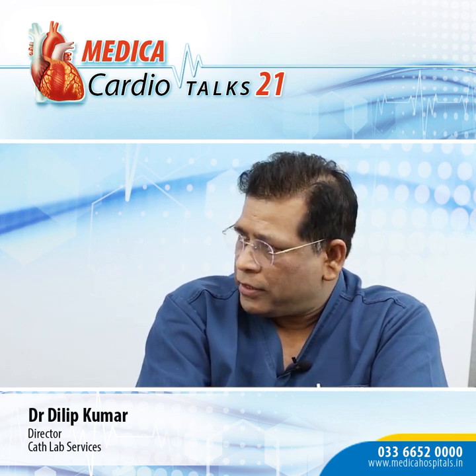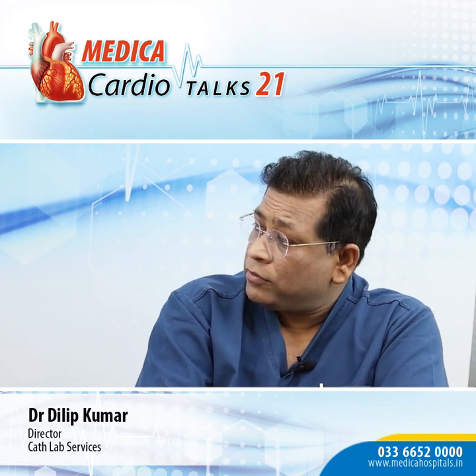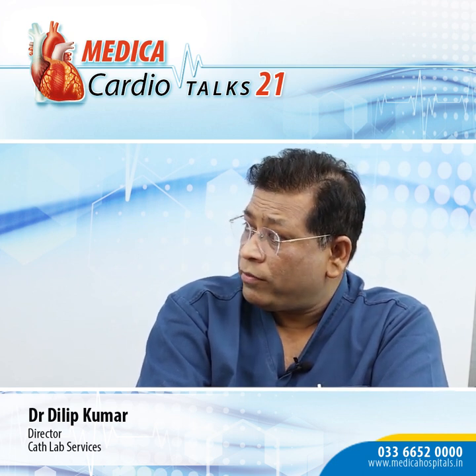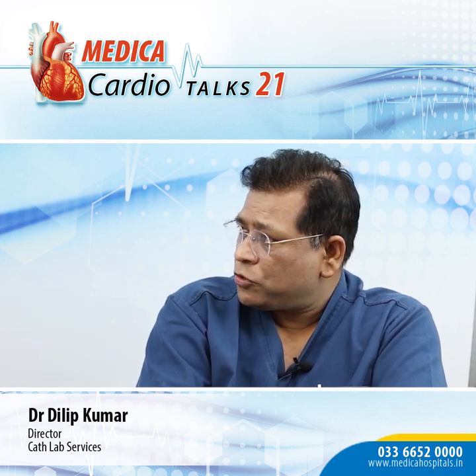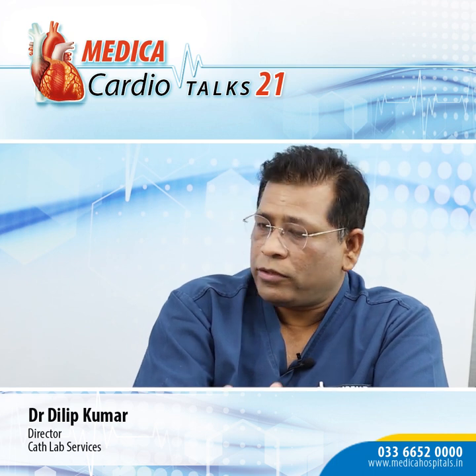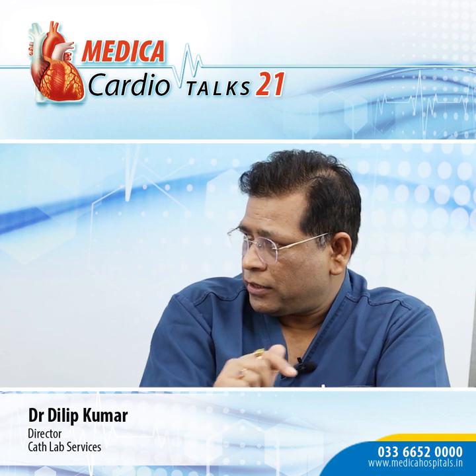Within TriLuminate, the data is there, and these results are really acceptable. The success rate of these procedures with TriClip is around 85-90%. One-year mortality is around 6 to 7%, so it's very acceptable. And 30-day mortality was 0 in the TriLuminate data.